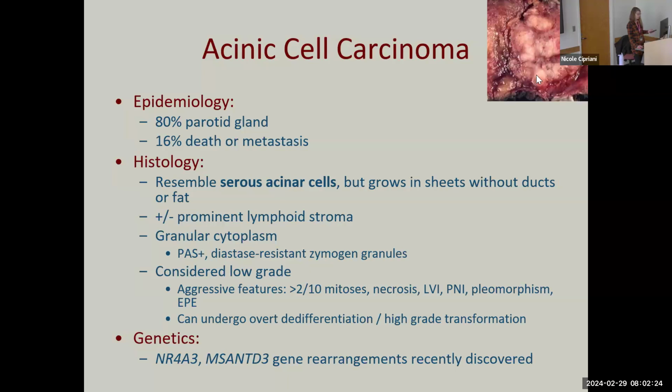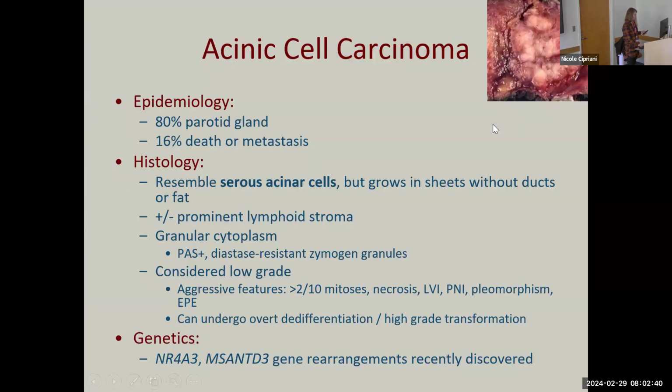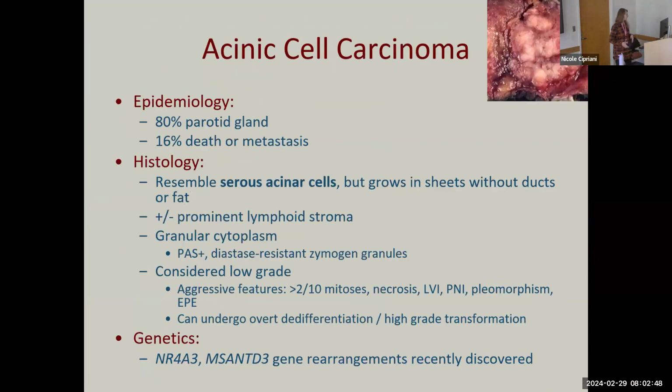Okay. Hi. Amazing. Okay. So I think we stopped last time around finishing. No? Yep, finishing polymorphous and cribriform polymorphous. Does that ring a bell? Okay. So we'll move on to acinic.